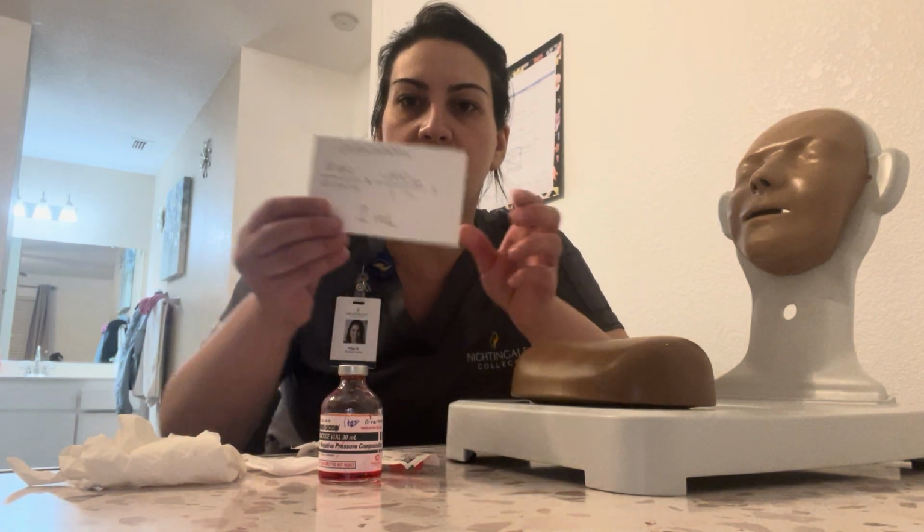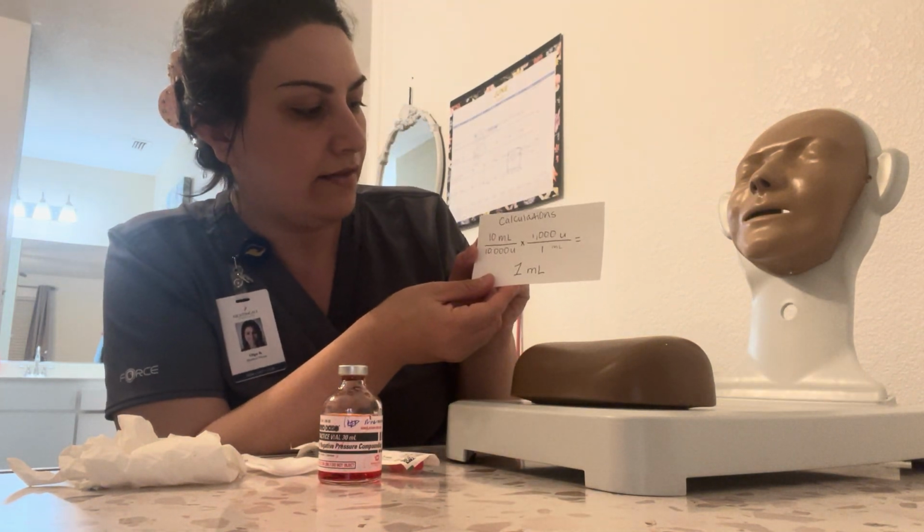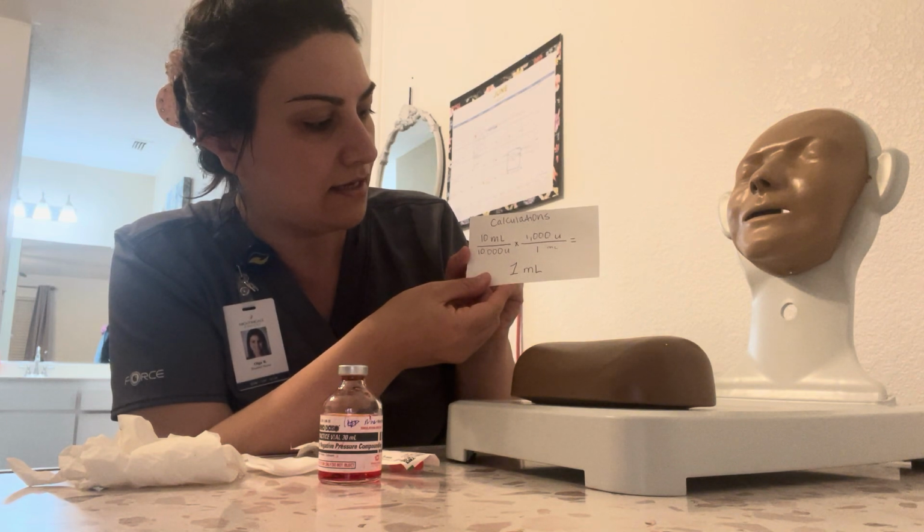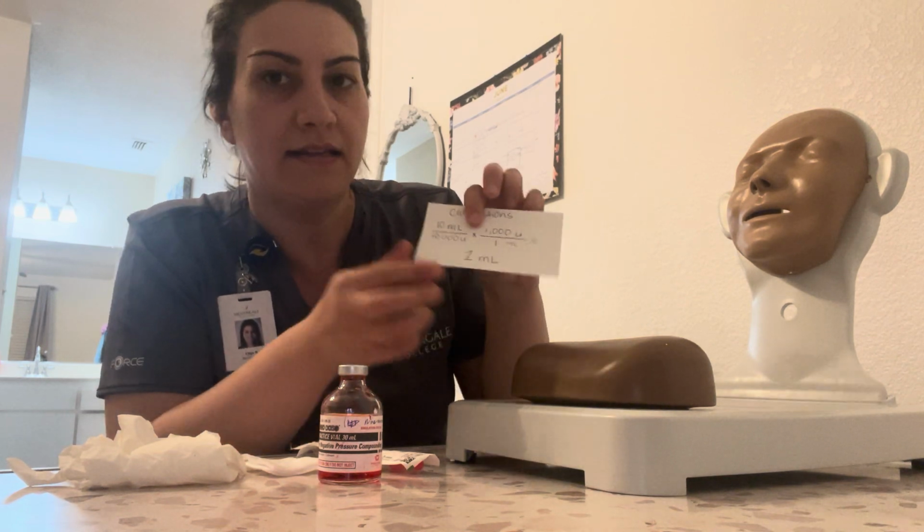Patient is going to be receiving heparin injection. The dose reads 1 milliliter over 1,000 units. So patient is going to be receiving 1 milliliter of that. I have the calculation dosage right here, nothing in the back. It reads calculation 10 milliliters over 10,000 units, times that by 1,000 units over 1, and it's going to be equalizing to 1 milliliter. I'm going to set this aside here.